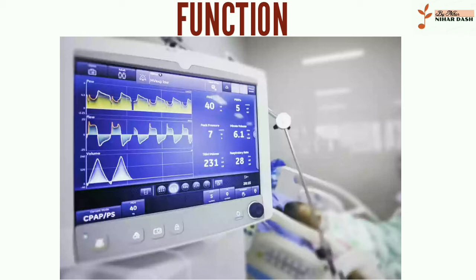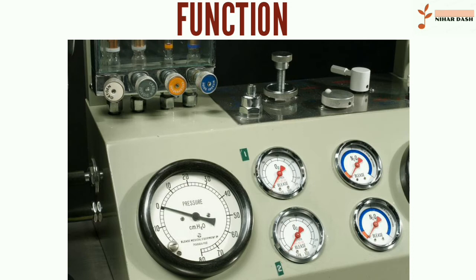The air reservoir is pneumatically compressed several times a minute to deliver room air, or in most cases, an air-oxygen mixture to the patient. If a turbine is used, the turbine pushes air through the ventilator, with a flow valve adjusting pressure to meet patient-specific parameters. When overpressure is released, the patient will exhale passively due to the lungs' elasticity, the exhaled air being released usually through a one-way valve within the patient circuit called the patient manifold.